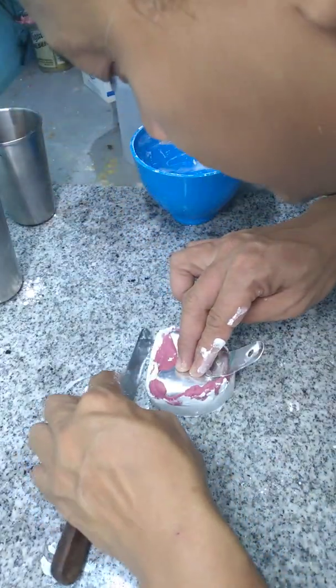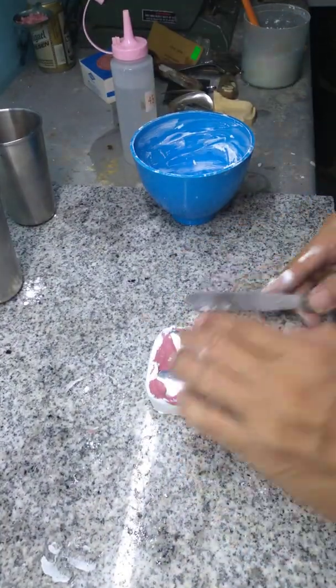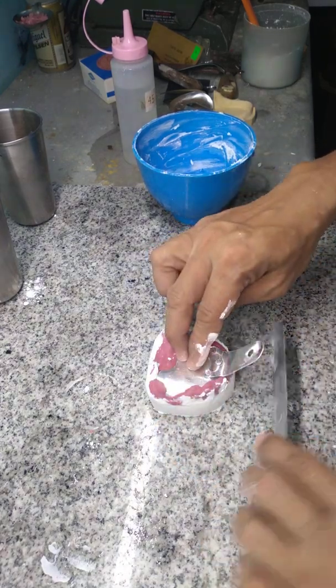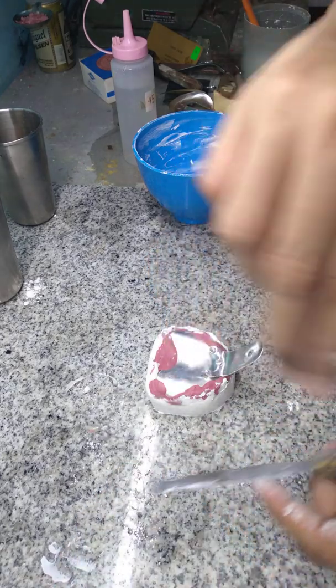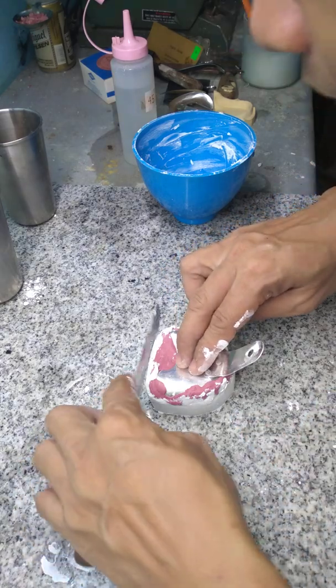As always, maintain a safe working area. We'll just wait for the plaster of Paris to set — it's around 40 to 45 minutes.